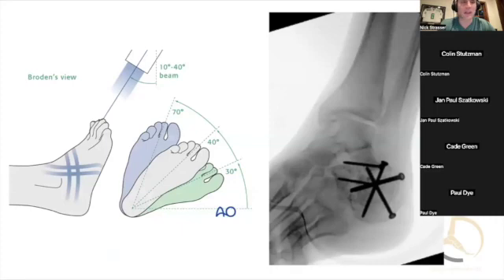Tips for getting a Broden's view — sometimes I struggle to get this. What are you looking for? I try to get a bad mortise view. That's a good tip — a bad mortise. And then usually you over-rotate and that's kind of what I almost aim for.